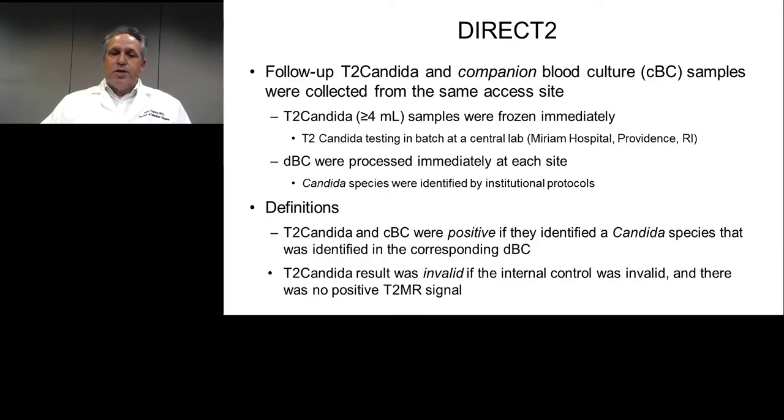So T2Candida and the so-called companion blood culture drawn at the same time were defined as positive if they identified a Candida species that was identified in the corresponding diagnostic blood culture that was originally drawn and identified a Candida species.